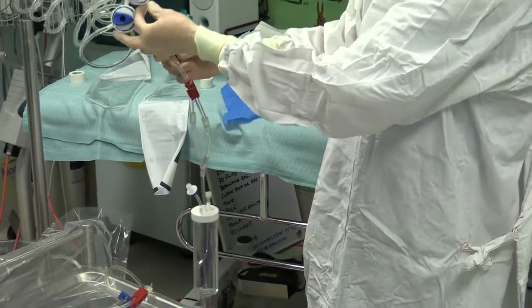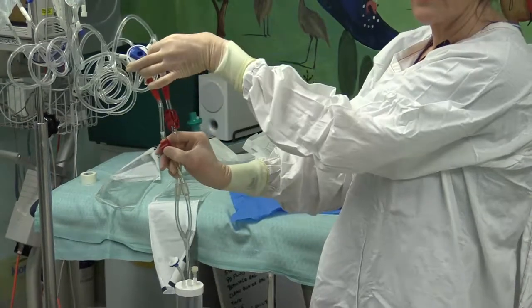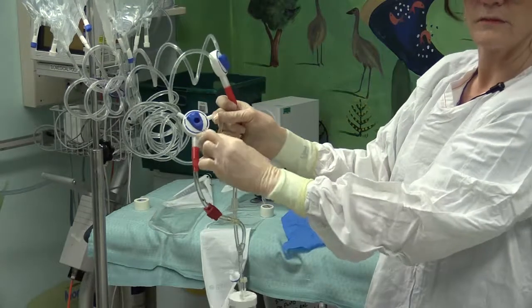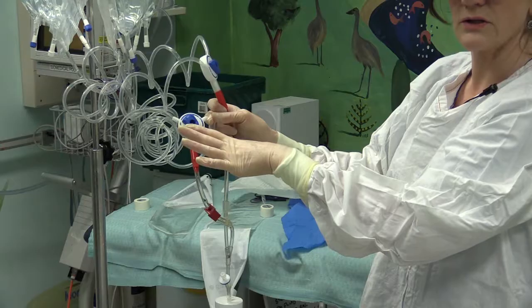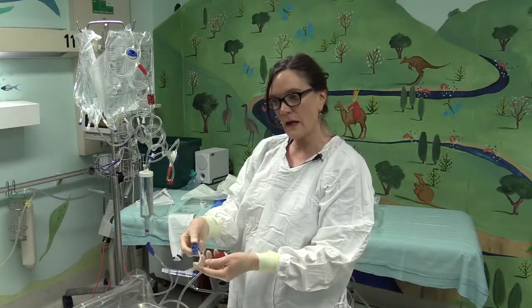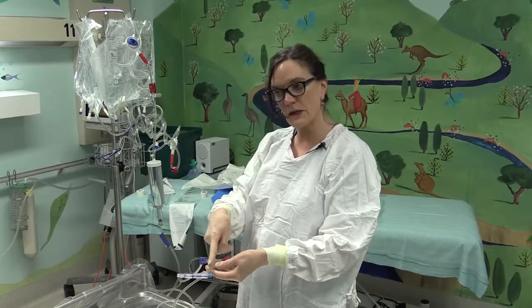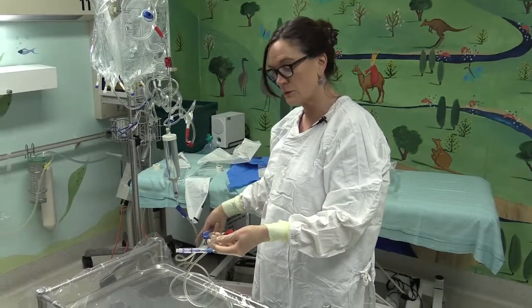It's full now, so clamp the red clamp. And leave that pointer on the dial on number 3, and it should stay there for the duration of the dialysis. I now need to remove the air out of the tubing that goes to the patient, and also out of the tubing that will be going to the drainage burette.